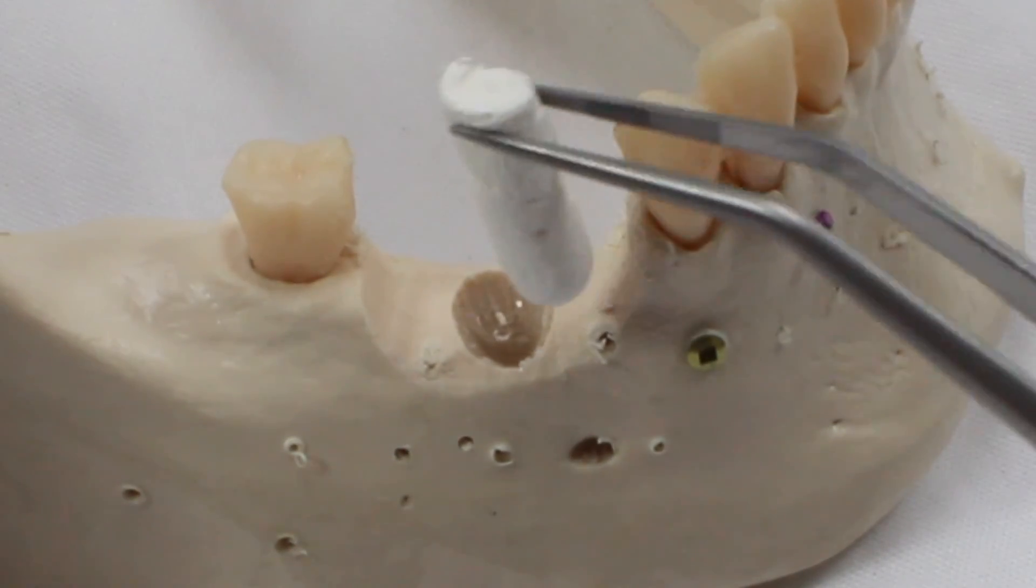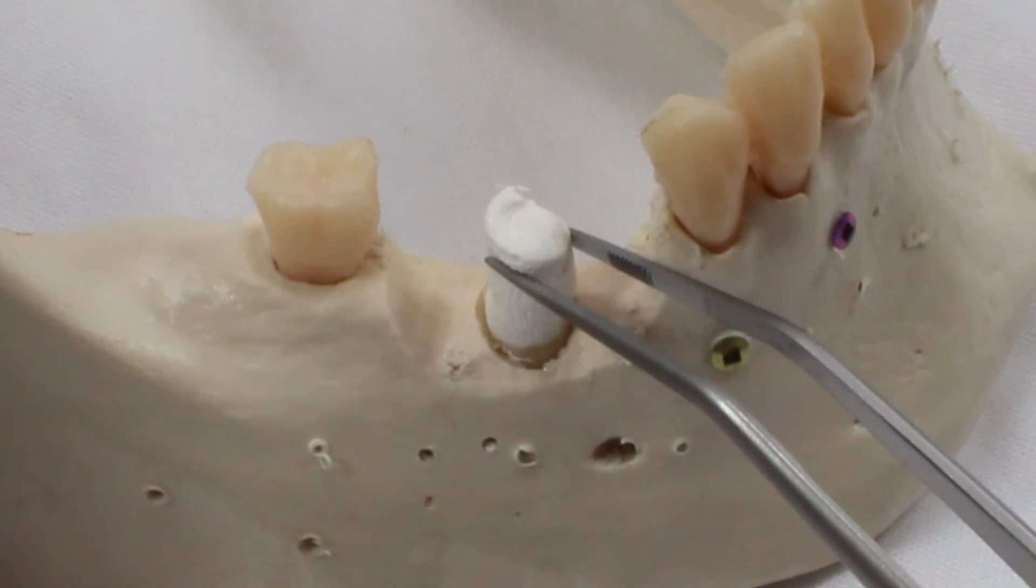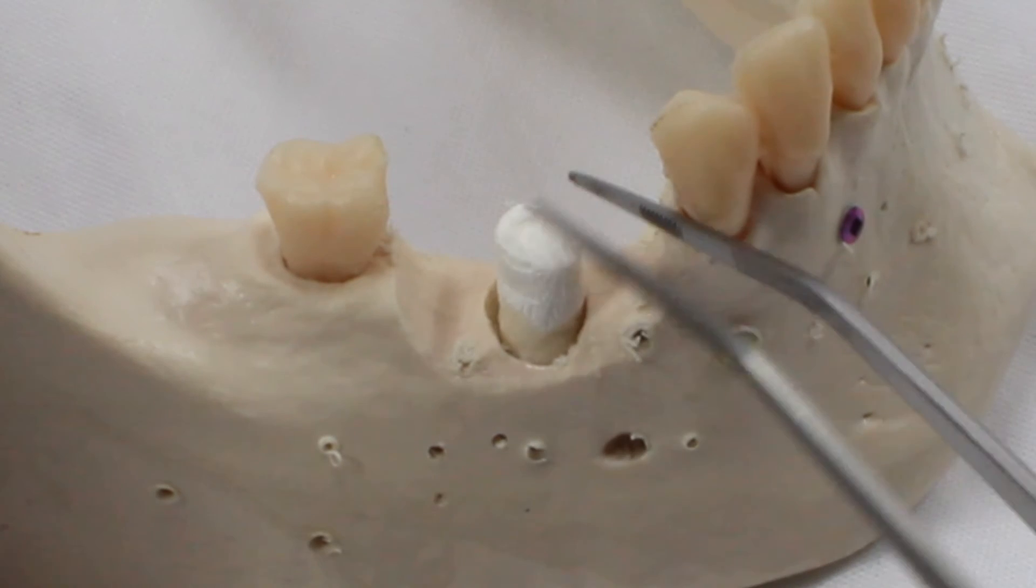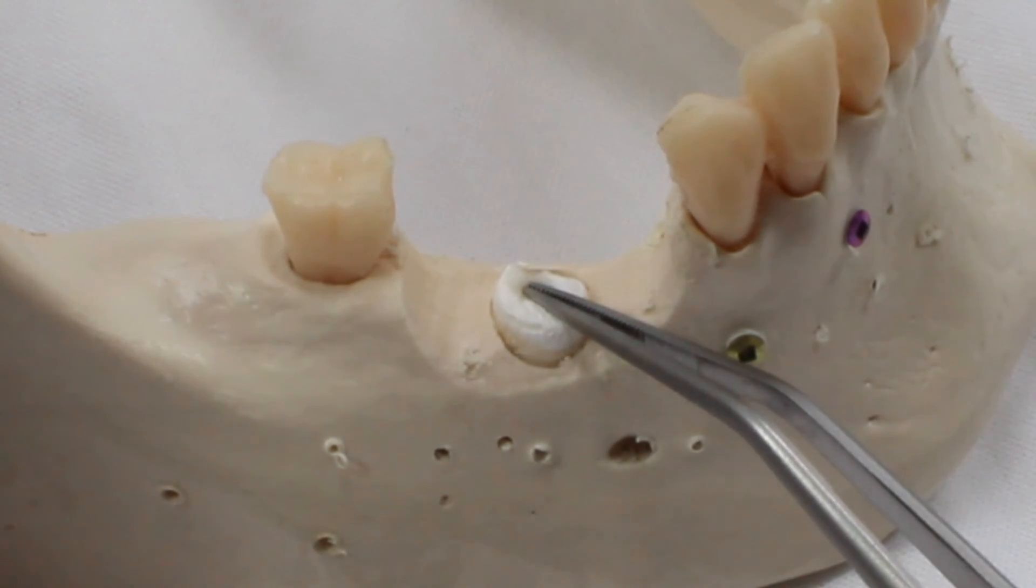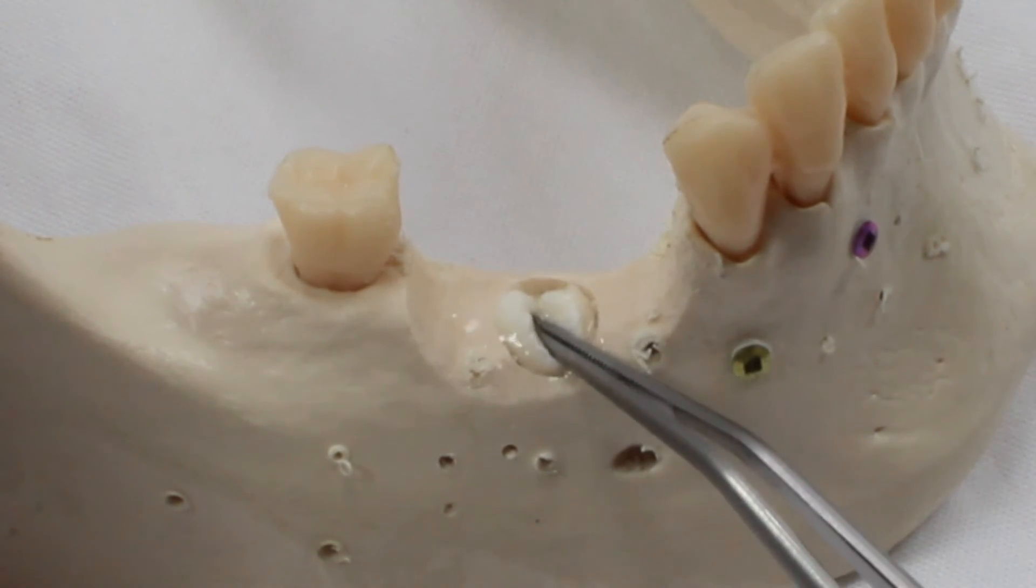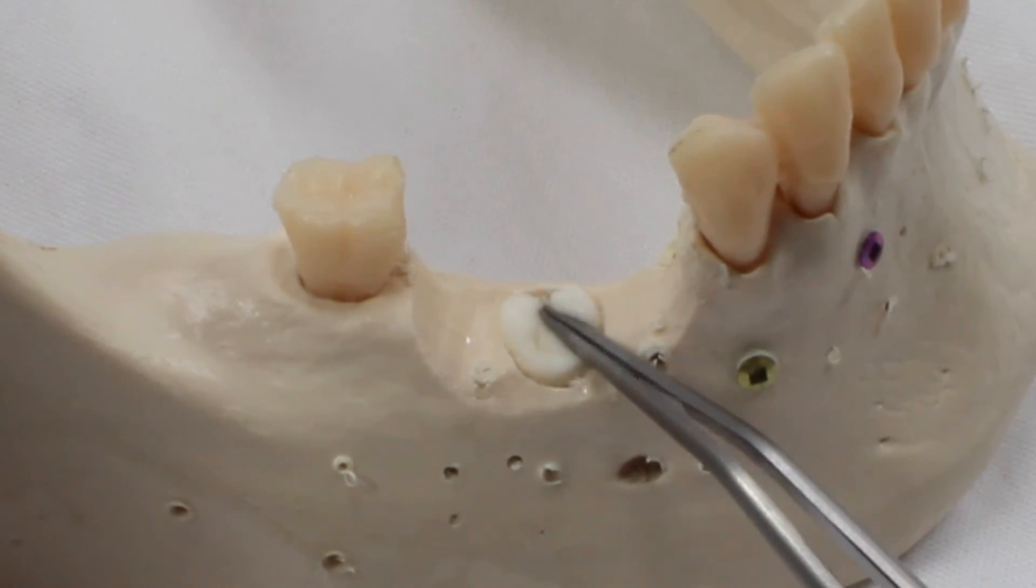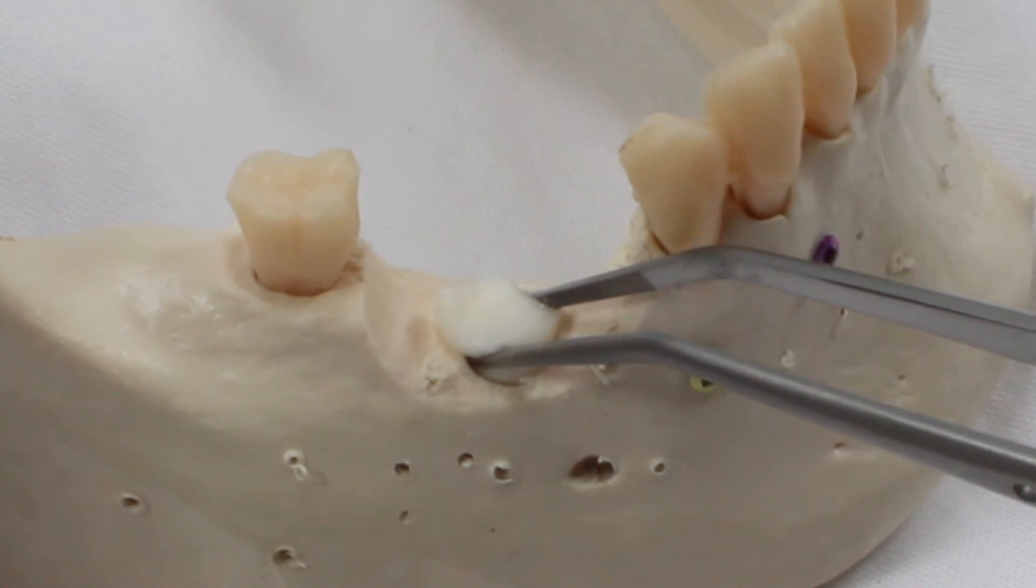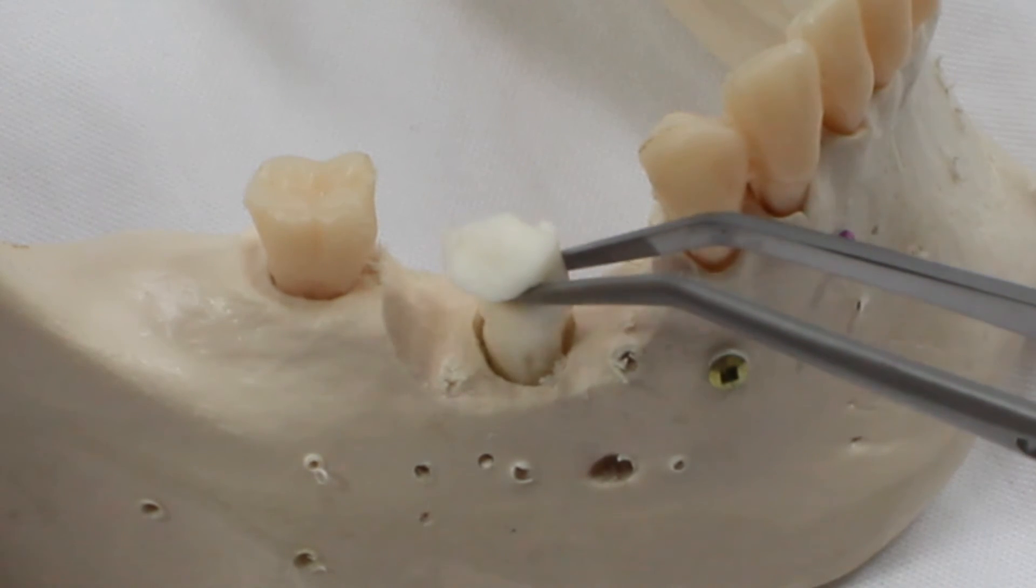Place the Osteogen Plug into the socket and let it absorb blood. Just crisscross suture over top to retain it into the socket. Here we remove the Osteogen Plug to demonstrate that it has conformed to the root shape but still retains enough strength so it does not fall apart as it is manipulated.